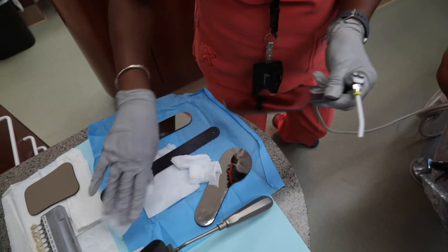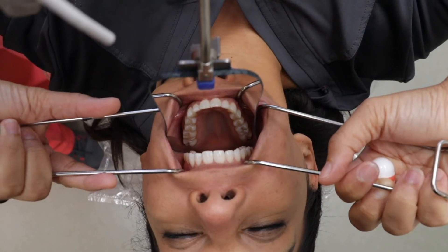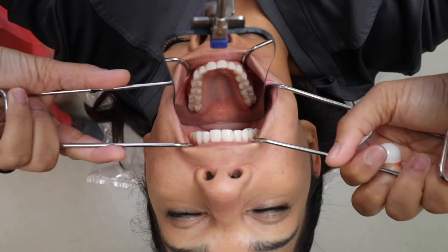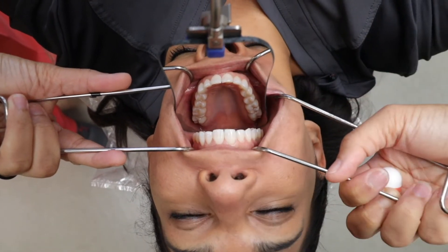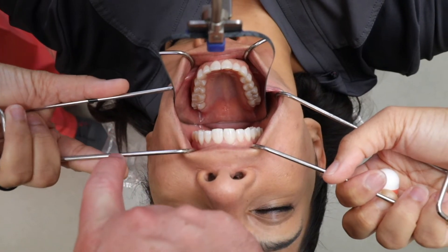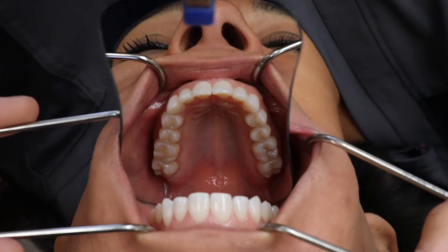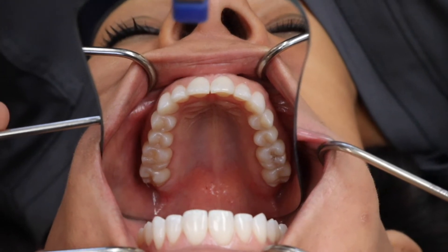As the person holding the camera, I can see from the camera's perspective what is going on with the retractors, mirrors, and everything else in the image. I act as a director, helping the patient properly position the retractors, telling them how to hold their teeth — whether fully closed, slightly open, or wide open. I also help the assistant position the mirror in the best location and they help me with moisture control.